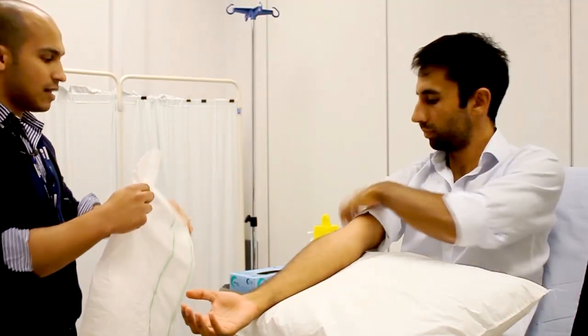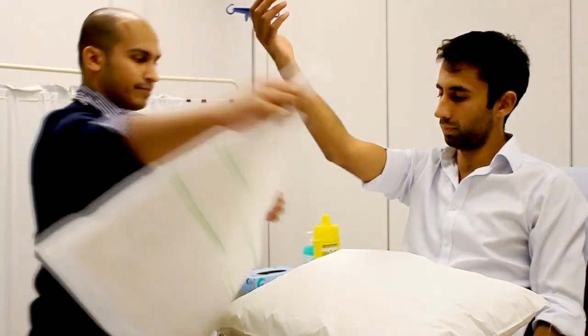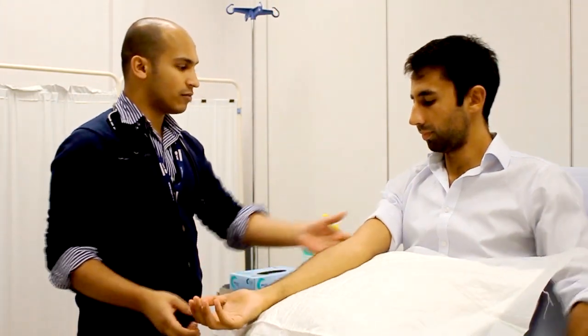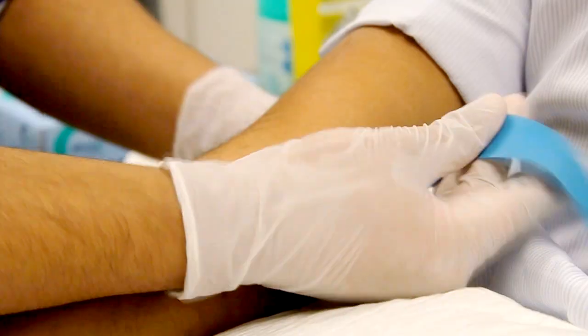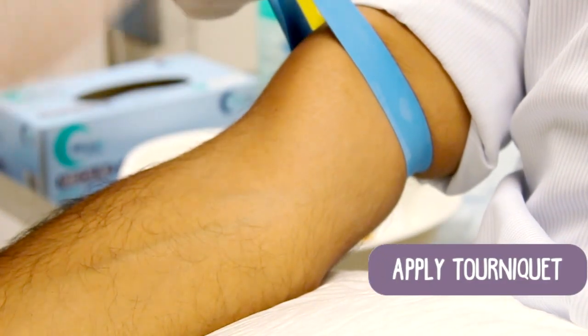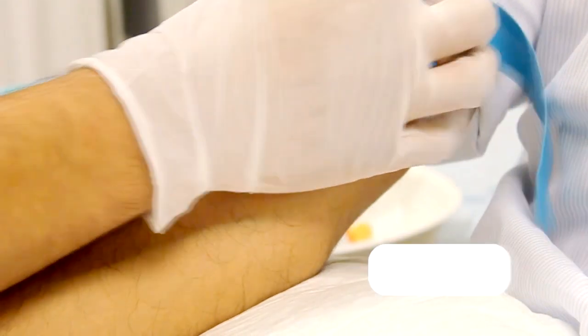The positioning of the arm is really important. If you are going for the antecubital fossa, the arm should be nice and straight — often popping a pillow below it is really useful. You have to be comfortable yourself in your positioning and the positioning of the patient's arm. A good tip would be to put an inca pad below the arm so that if there is a bit of blood, it's not going to stain the pillow.